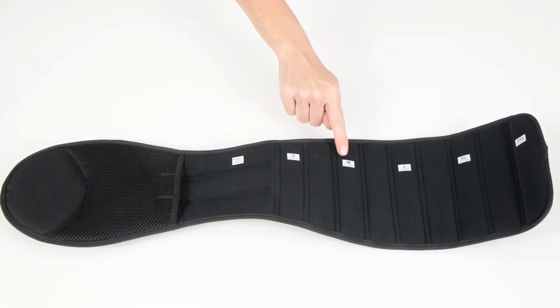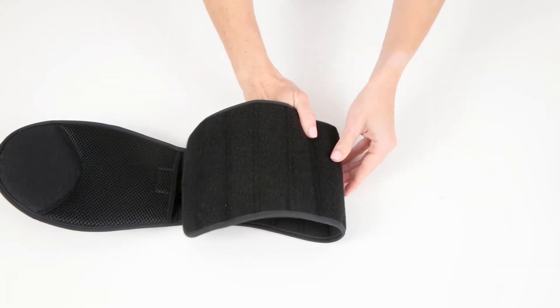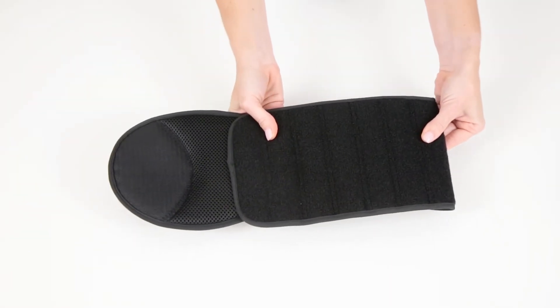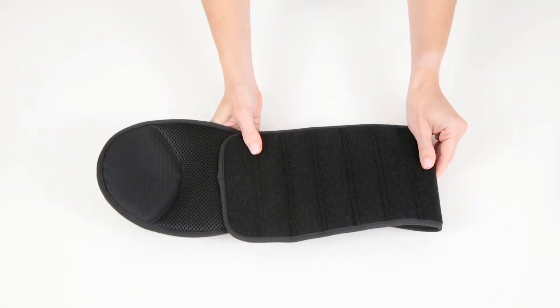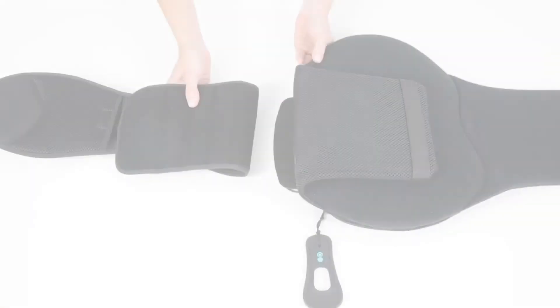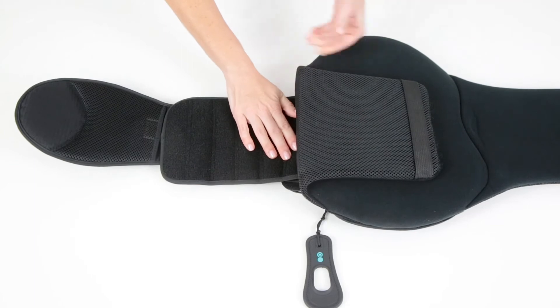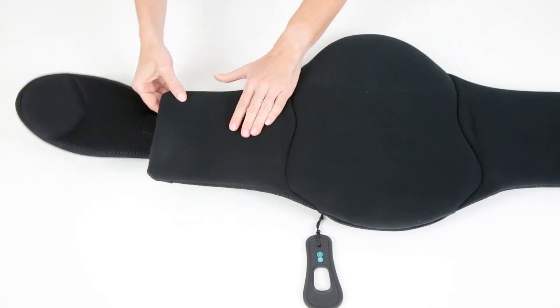Fold each side of the belt to the desired size. Use the additional hook and loop tab to secure the straps in place. Reattach the straps to the fastener tabs on the back panel and close the panel cover.